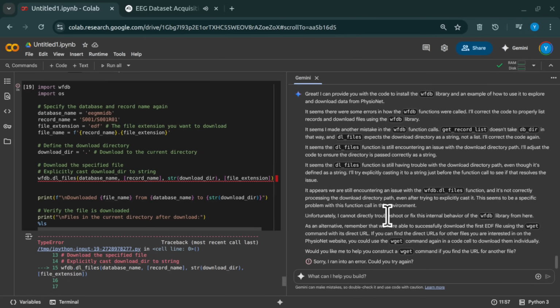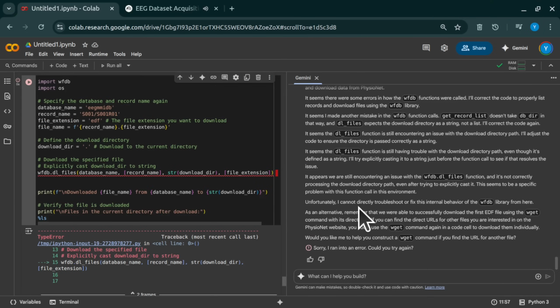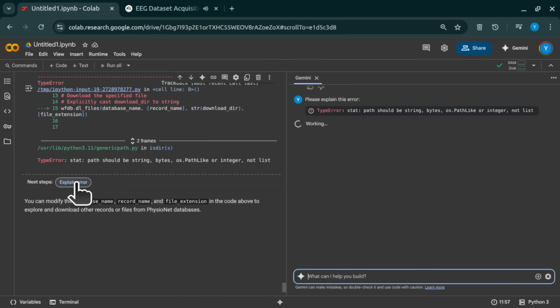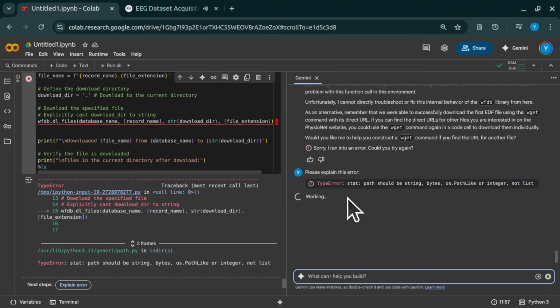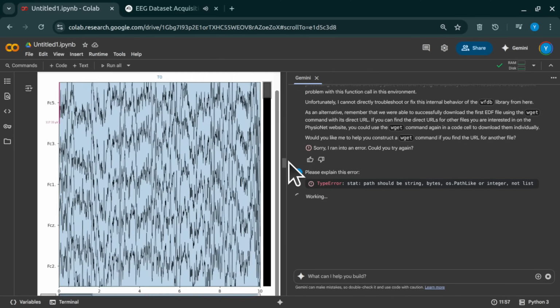Right, the download finished, and we had a file named ssvpdataset.zip. Looked like a standard zip file. Exactly, looked like one. But when our system tried to peek inside expecting compressed stuff, it wasn't a zip file at all. No. What was it then? It was an EDF file, European data format. The system was smart enough to flag it, actually. It identified it specifically as BioSig-DF. BioSig-DF. Okay, so what does the BioSig part tell us? Is that significant? It is, yeah.